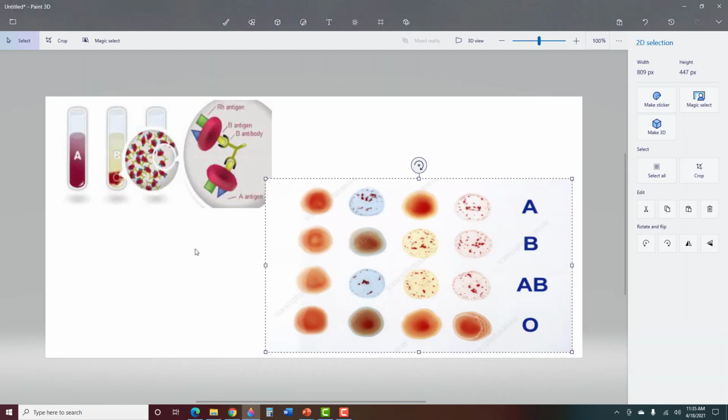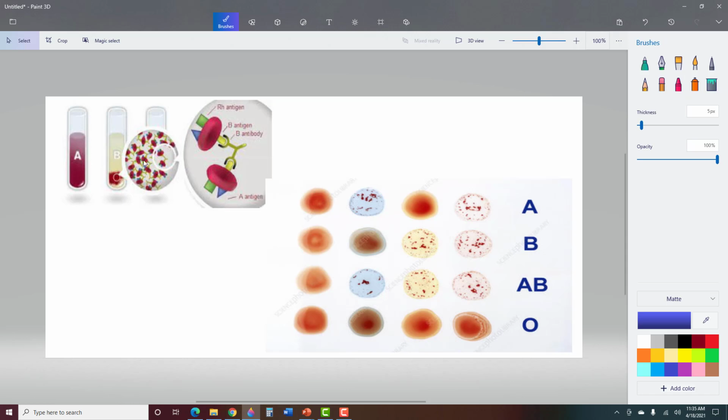All right, so when you do a blood typing test, you can see clumping. So here is what a blood test might look like for someone who is A. This would be the A antigen here, and it's not important what it looks like. It's just that you can see a difference. So this is non-clumping blood. This one here, you can see that. And this one is clumping. So notice the difference: non-clumping, clumping.